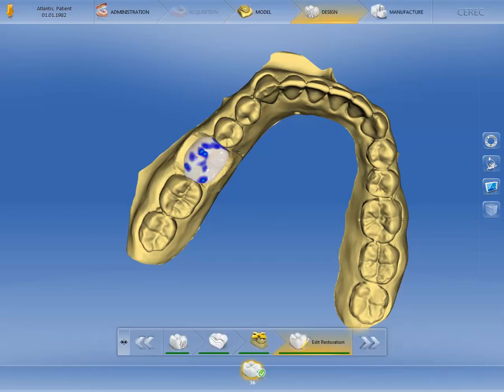Based on the biogeneric individual design mode, the CEREC software has now calculated a design proposal, which we will now look at from different angles.